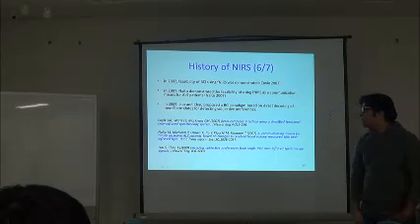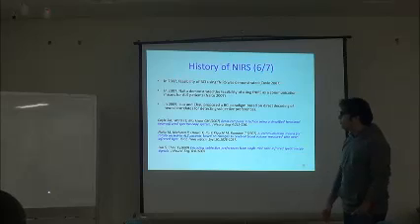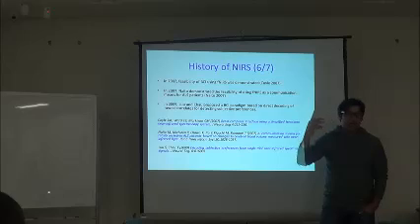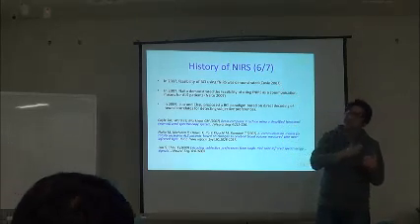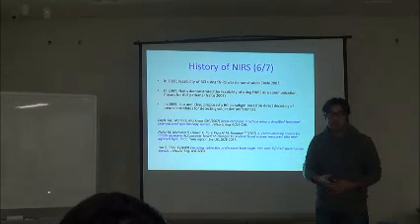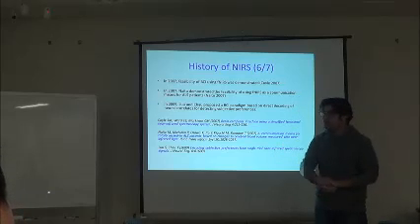And in 2009 there was another interesting piece of research. Liu and Chow proposed a BCI paradigm based on direct decoding of neural correlates for detecting subjective preferences. Previously, people had asked the subjects to perform some activity to activate some area, and they classified that against the rest period or against another activity. These researchers said that from the neural correlates, you don't have to perform any specific activity. You just have to think naturally, and fNIRS can get the signals out of your brain.